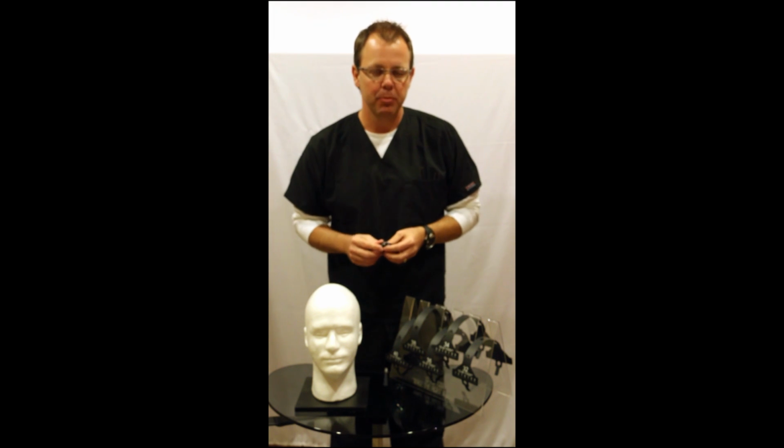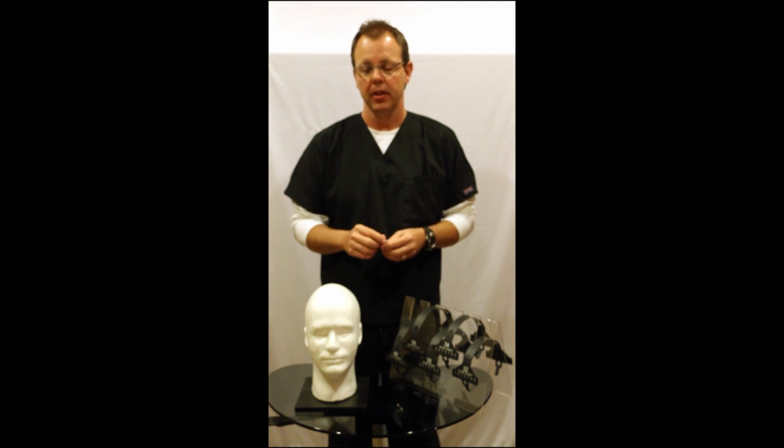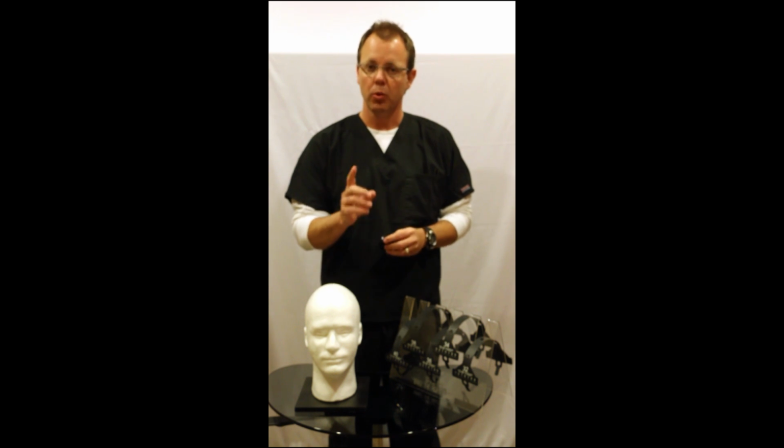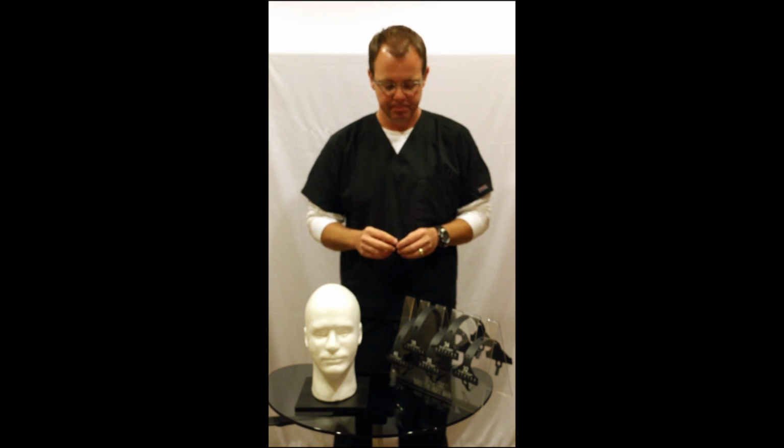Okay, now I would like to demonstrate how quickly the 1020 tool can measure the head for a modified or full EEG. Okay, ready? Start the clock.